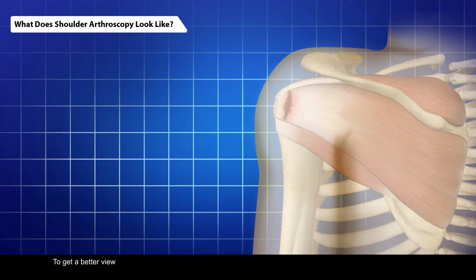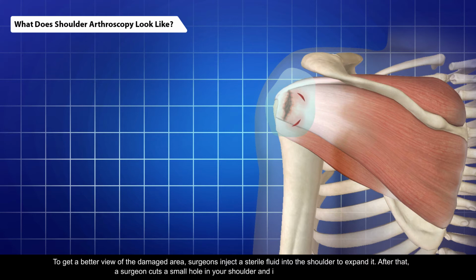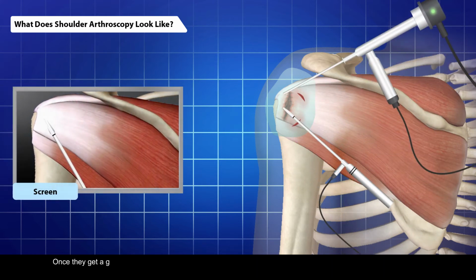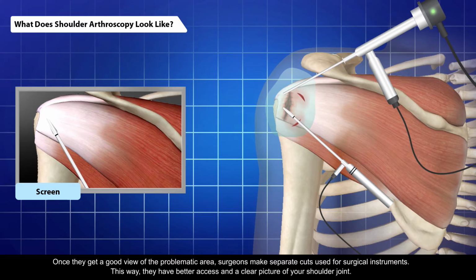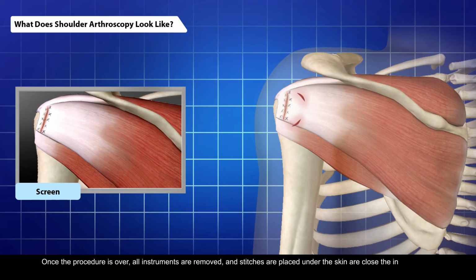To get a better view of the damaged area, surgeons inject a sterile fluid into the shoulder to expand it. After that, a surgeon cuts a small hole in your shoulder and inserts the arthroscope. Once they get a good view of the problematic area, surgeons make separate cuts used for surgical instruments. This way, they have better access and a clear picture of your shoulder joint. Once the procedure is over, all instruments are removed and stitches are placed under the skin to close the incisions.